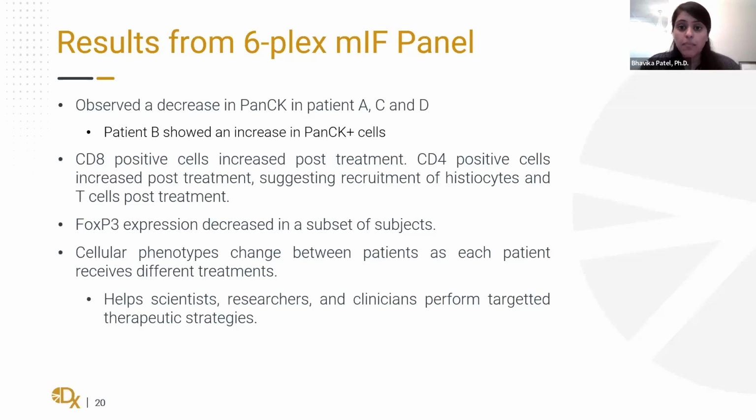We also observed that FOXP3 decreased in a subset of patients, indicating those patients may be responding to their treatments better. Overall, cellular phenotypes change between patients as each patient receives different treatments. Our panel was utilized in order to better understand the T helper cells and tumor cells within the microenvironment. Multiplex panels, such as the ones that I just presented, may help scientists, researchers, and clinicians make informed decisions on patient care, as well as provide more individualized treatment plans.